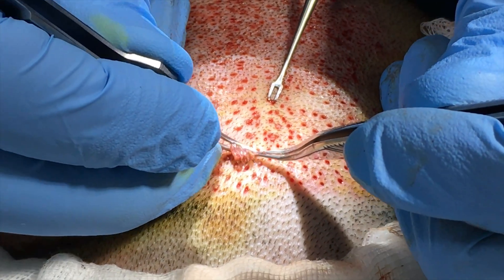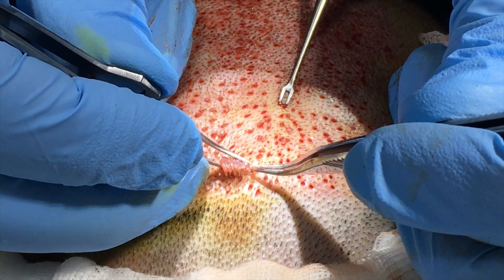There's more than one way to harvest follicle units via FUE. The standard way in my practice is to shave the donor area — the back and sides of the scalp — to 0.8 millimeters in length. Then, using the visible stub of the hair shaft, we take a rotating, sharp, serrated punch that scores the skin around the hair follicle, and we gently remove the follicle from its place. We then place them in the graft storage solution.